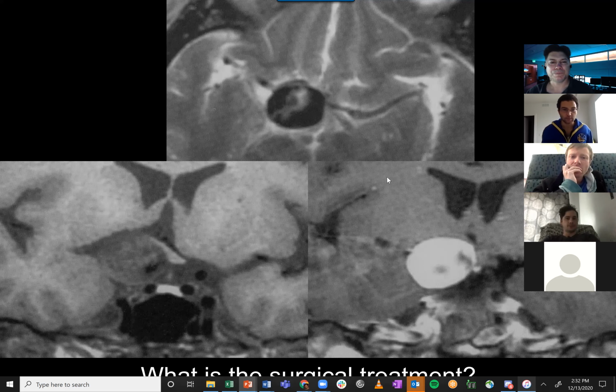The surgeons think it's a schwannoma, so they're going to the OR to resect it. What do you think about that? Some of them think it's a meningioma, and some think it's a schwannoma. Which do you want to bet on? Well, whenever someone asks me to biopsy something, I have to say no. That's the default answer on a board exam, is never biopsy something.